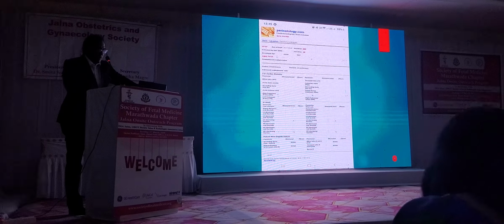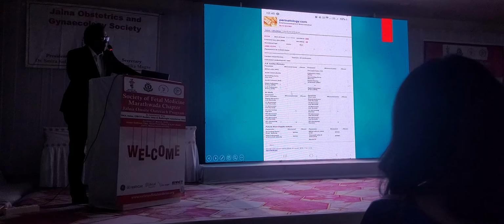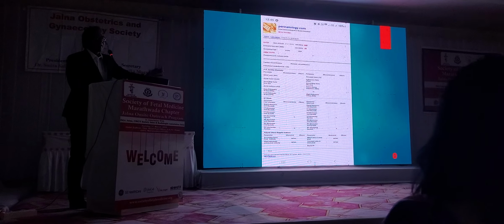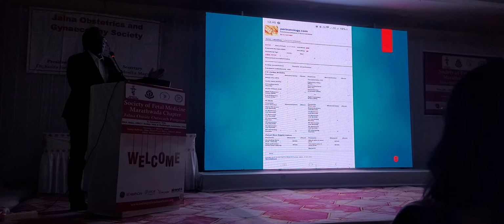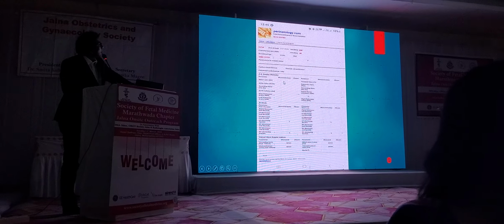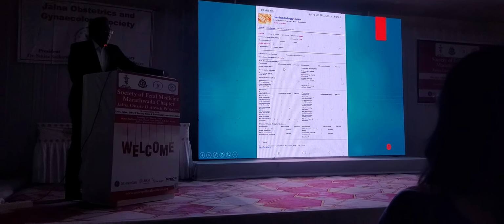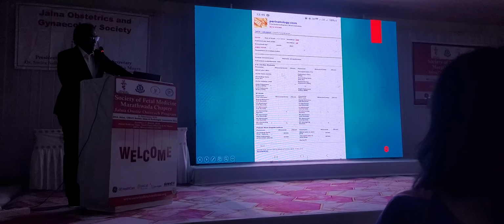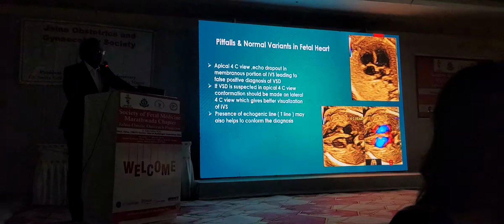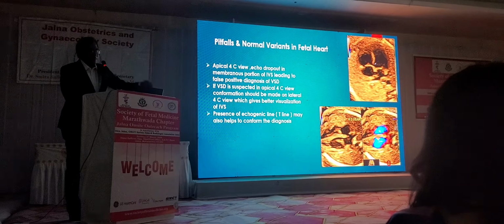So there is a long list of fetal biometry. Once you find an abnormality, all your protocols and basic guidelines should be kept away and you should do a detailed fetal biometry. All these charts are freely available on perinatology, and in advanced machines they have an inbuilt chart for Z score nowadays. So once you find an abnormality, you can't stick to the basic protocols, as just said by Sani sir.